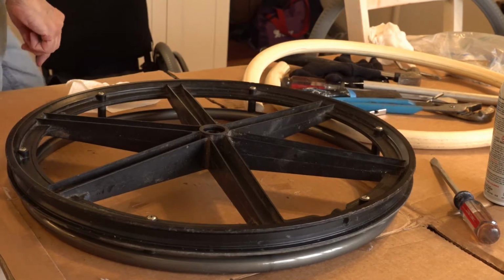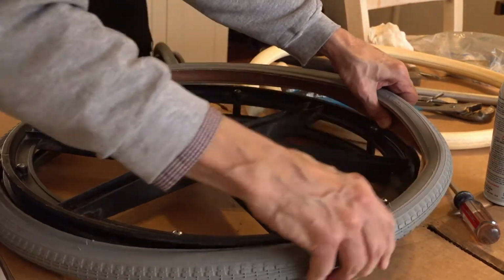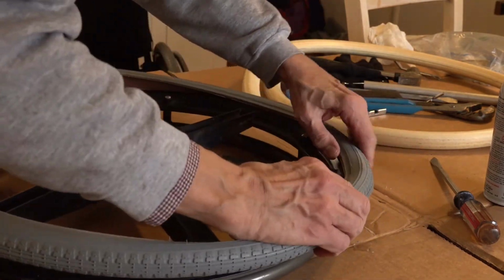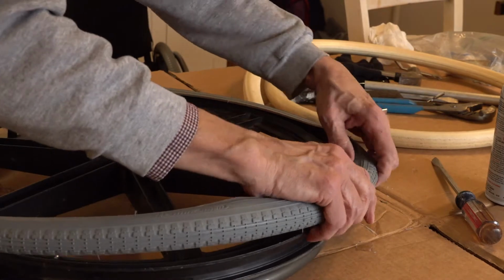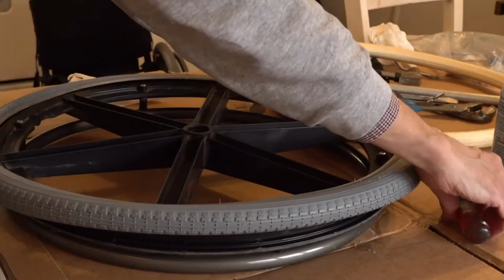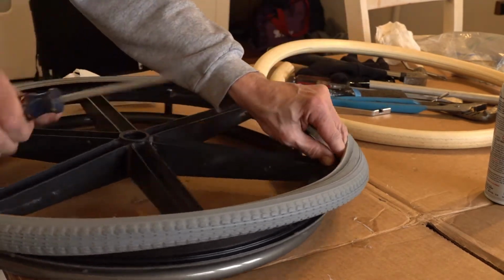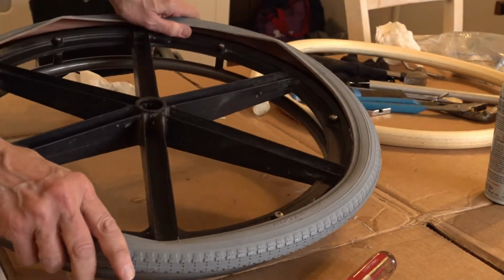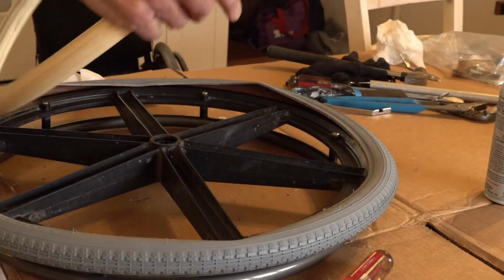Okay. Now we have our new tire. Put on, and this just goes on. Just put on one edge of it, one side edge. A little help from our screwdriver here to get the last pieces on. Okay, so half of it is on, the other half is still yet to go on, but before we do that, we have to put our insert back in.